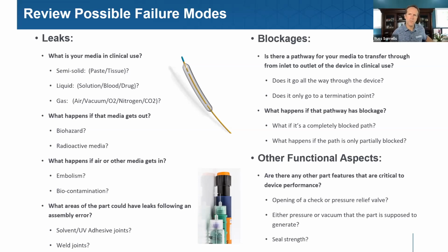Do you see those mostly being tested prior to fill or post fill using some type of vacuum decay technology? What's the most common method out there? Excellent question. In our case, we typically specialize in the pre-filling process. We will see this happen one of two ways. The customer is testing, and I'll address this in the next slide also, are they testing them 100%? Or are they testing only audit or a sample batch? Depending upon that, that'll oftentimes lead to different requirements that the customer may have.